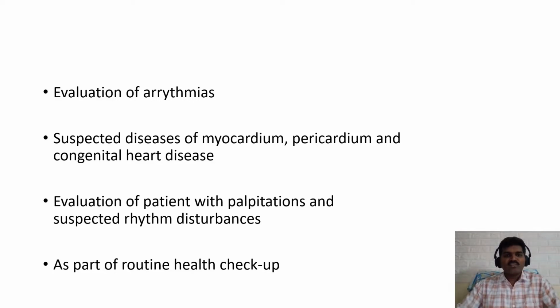Diseases of myocardium, pericardium, and congenital heart disease can be detected using an ECG. Evaluation of the patient with palpitations and suspected rhythm disturbances, ECG is the best method, and it is also useful as part of a routine health checkup.